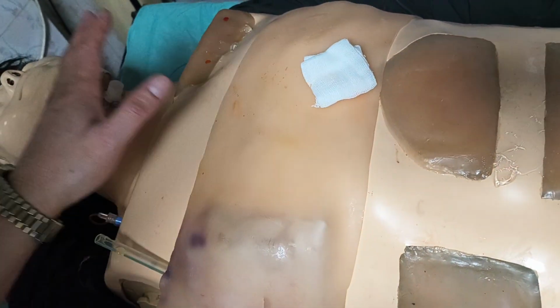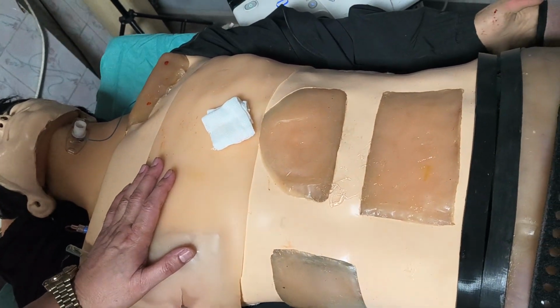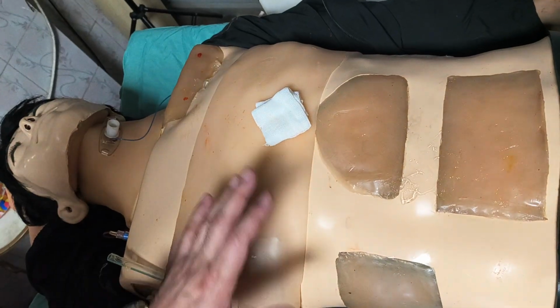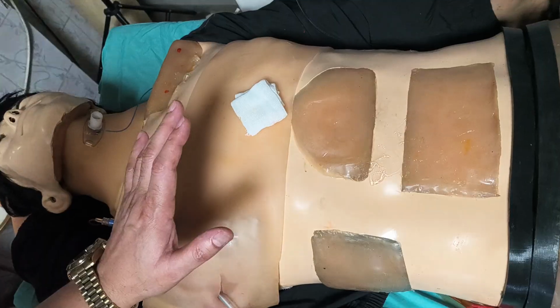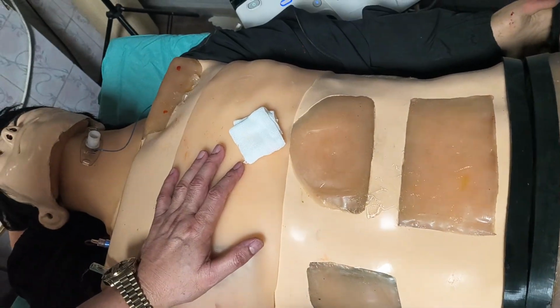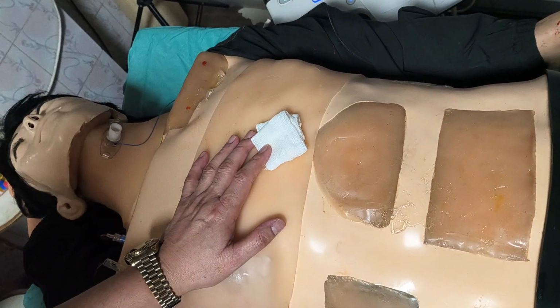So these are the various features we have incorporated in this moulaged patient, and hopefully if somebody detects all the problems and resuscitates this patient, I think we can call him a well trained person. Thank you very much.